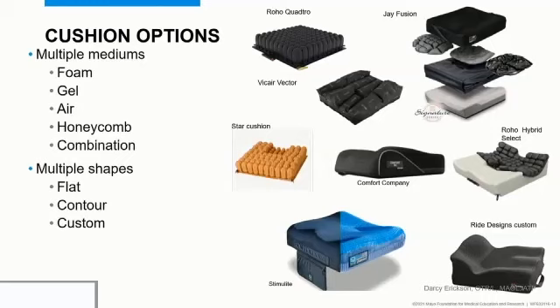But it's important things that we really need to know, and that there's multiple mediums and there's multiple shapes, and not one is going to fit everybody. So the qualities and the properties have to be matched to the unique end user's needs to really get them to that best position. So when we talk about those cushion choices, the benefits of foam are that it's contoured as needed. You can carve it, you can move it, you can shape it. It's pretty low maintenance for the most part, and you can get that variable density and viscosity of 3 or 4 layers of foam, or you can build things up. So it's pretty versatile, and it's relatively low cost.